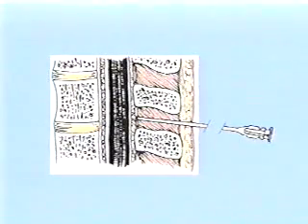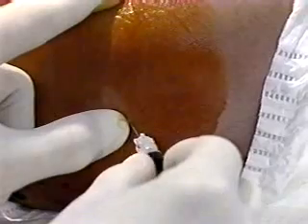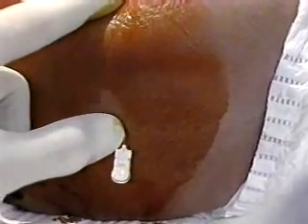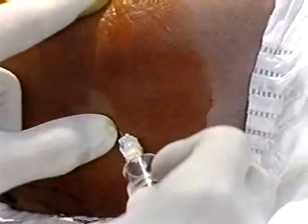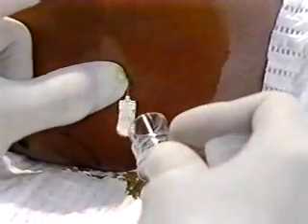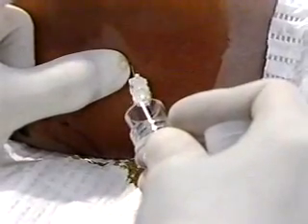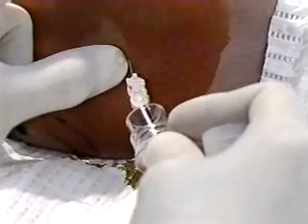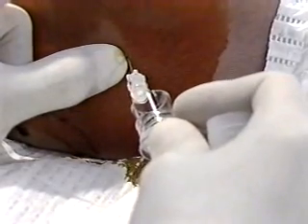Once the practitioner inserts the needle and does not meet resistance, the stylet may be removed to check for CSF flow. However, in many cases, the CSF will flow around the stylet while it is still in place and is easily visualized if the needle has a clear hub. In our experience, a pop is rarely felt when the ligamentum flavum and the dura are penetrated in the newborn, as is the case with older children.